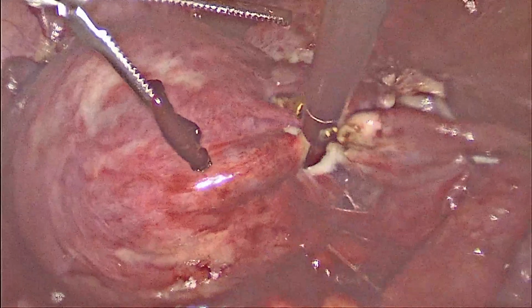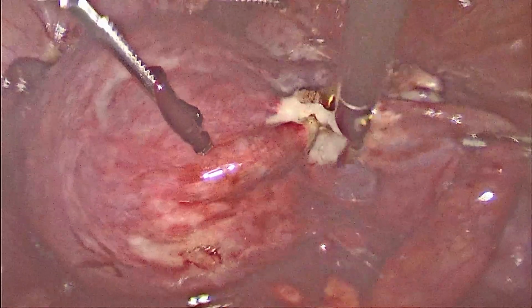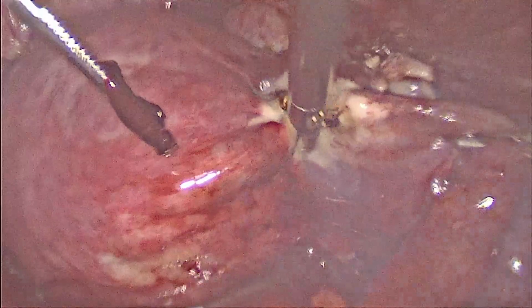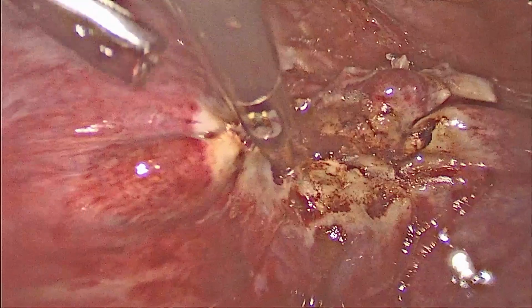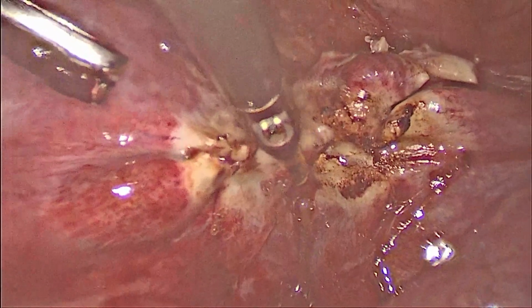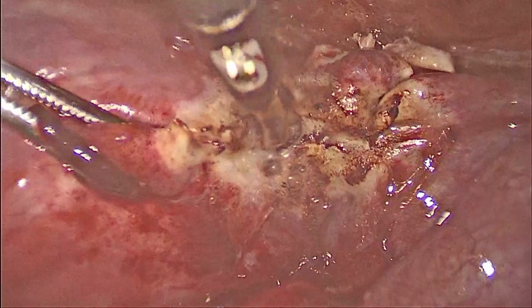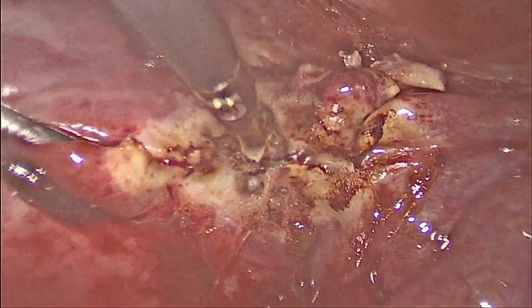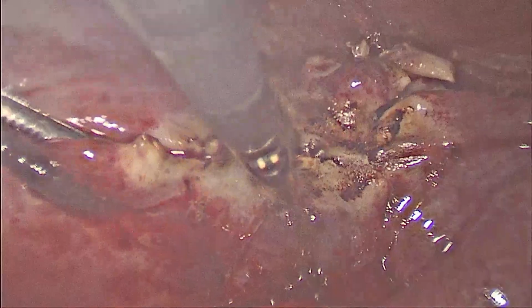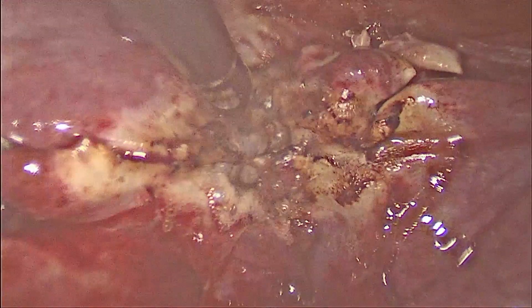So we are finding it difficult to separate the right adnexa from the sigmoid colon. So we are trying to divide the cornual pedicles before reaching the uterine vessels. And later, after completion of the hysterectomy, we can go and excise the adnexa on the right side.